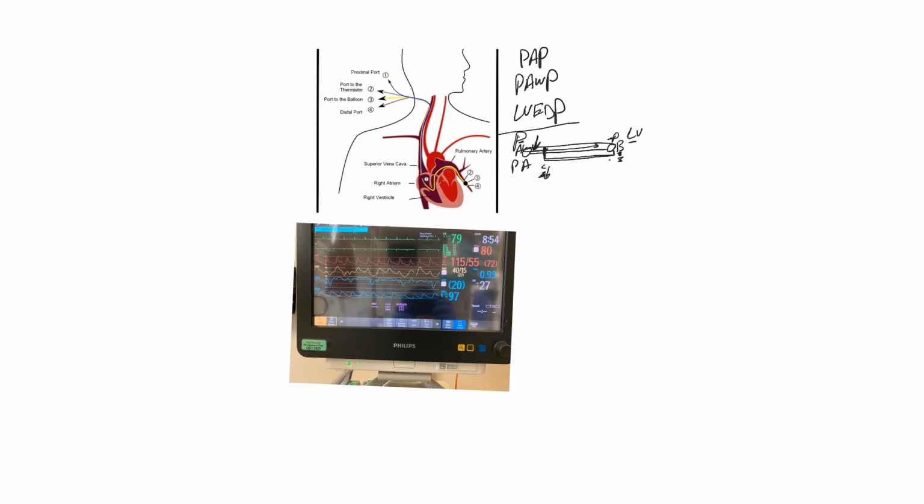Then you measure the pressure here, and it will give you the pressure here. That's how we say the pulmonary artery wedge pressure gives you an estimate, approximately equivalent to LV end diastolic pressure, as long as there are no obstructions, there is no turbulence, and the compliance is okay. So that's pulmonary artery wedge pressure.